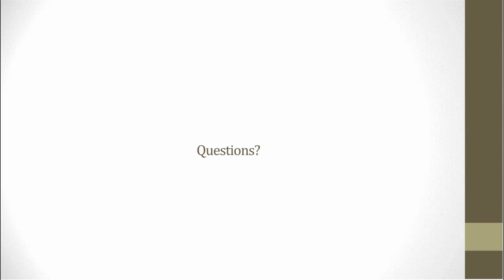Thank you. Next question. How often does Oncomine Reporter update content? So for us, at least what we're seeing currently is that we're getting updates on a monthly basis. We're seeing those come through for the standalone and the integrated versions of the software. If configured within the Genexus system, those updates can be as simple as clicking an icon within the software to update that content.